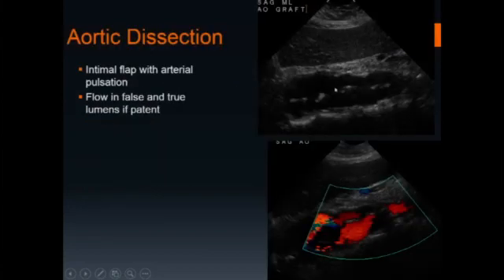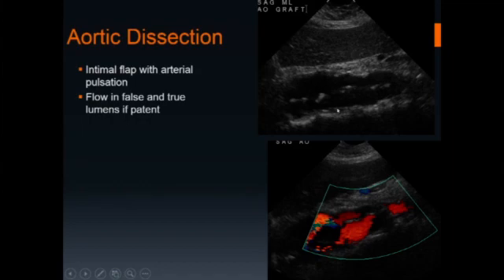This is an image of an aortic dissection. This longitudinal image demonstrates a linear hyperechogenicity within the lumen of the aorta representing the dissection flap. The false and true lumens are shown, and flow is seen in both the false and true lumens in this patient.